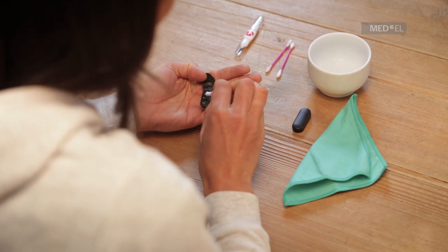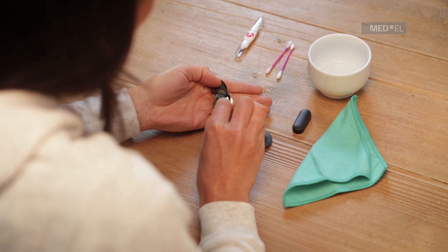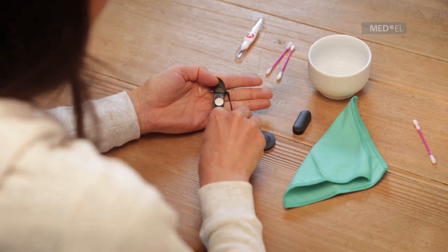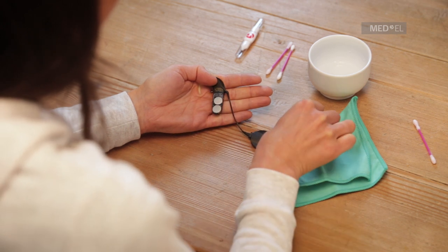To clean the battery contacts, use a cotton swab and a small amount of rubbing alcohol. Gently wipe them dry and avoid touching the battery contacts with your hand. Use the drying kit every night to allow your Sonnet to dry out completely.